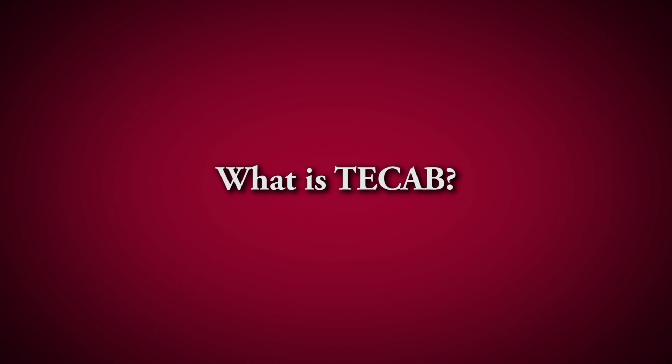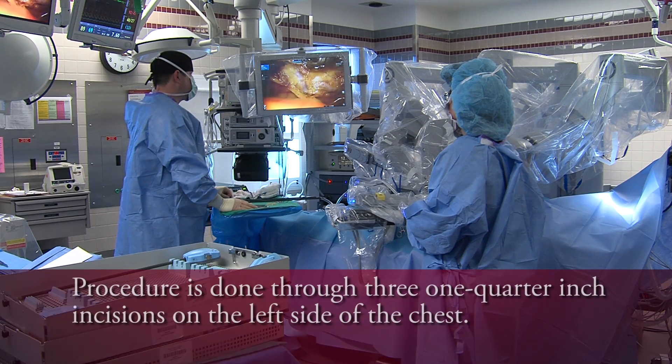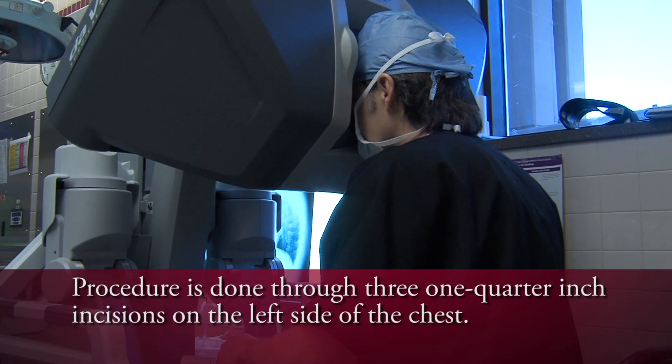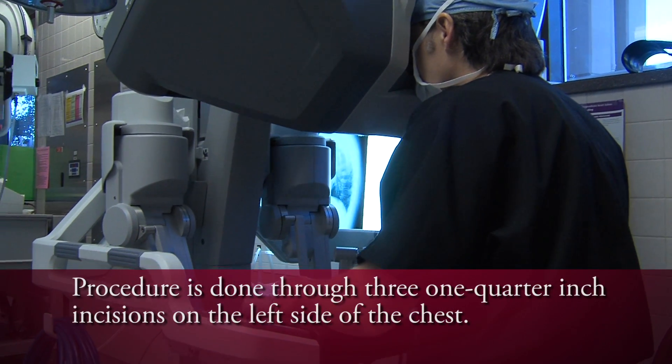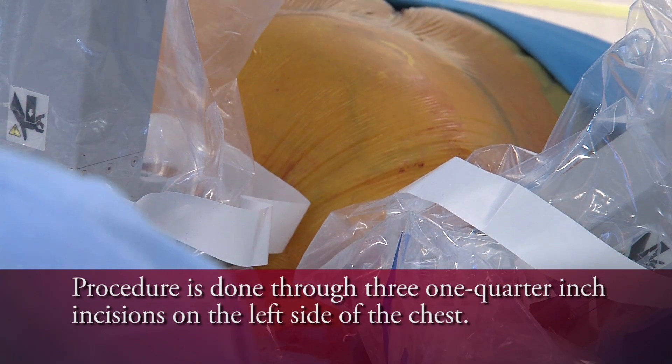T-CAB is totally endoscopic coronary artery bypass grafting. It means performing a coronary artery bypass surgery on a beating heart without opening the breastbone, without going on the heart-lung machine, and without making an incision in the leg. In other words, the entire operation is performed through three-quarter-inch incisions on the patient's left side of the chest.